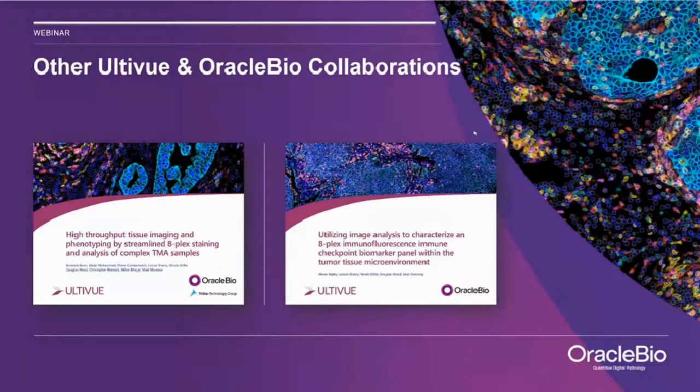We always start from DAB because, as I mentioned also during the presentation, this is the gold standard. So we always start from DAB when we work with a new antibody, and then we perform the antibody conjugation and we stain the slides with DAB with the conjugated antibody to make sure that conjugation has not affected the antibody performance. And then we move to singleplex and then to multiplex. So we really have a full standardized process to get to these validated kits.